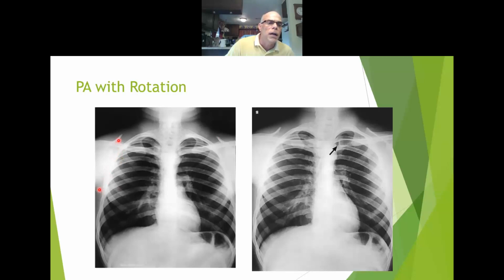I'm saying it is because I see it right there and then it comes down. Same thing there. You can see it's pulled out on this one. This one's pretty good. Can you see that faint line right there? It could have been pulled a little bit better on this one.